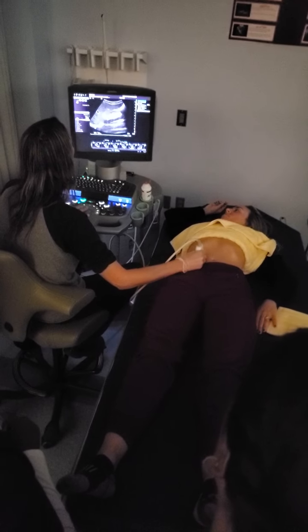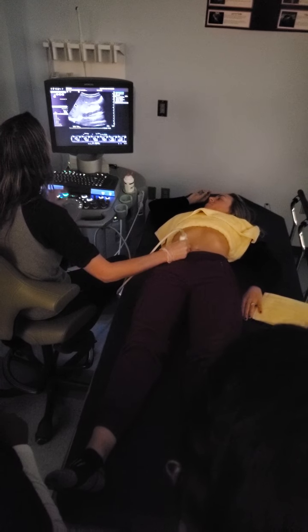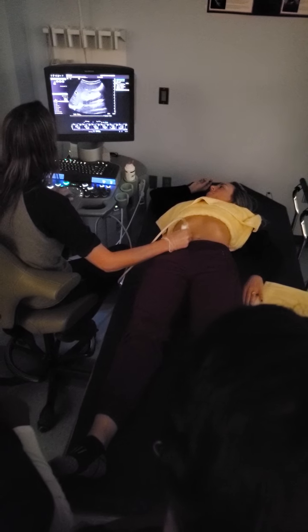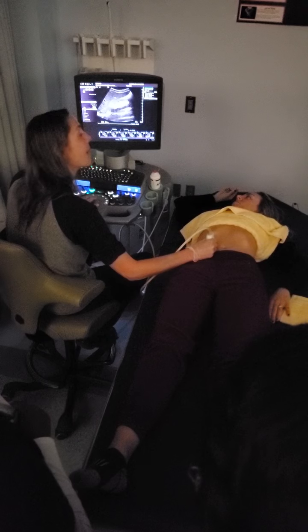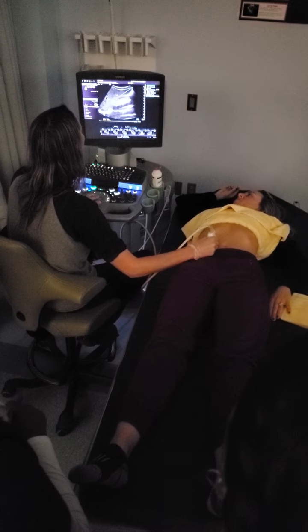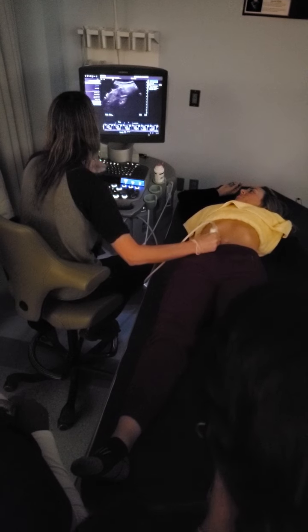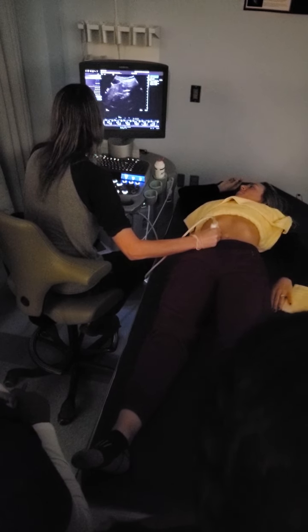Superior, posterior, right? And we want to make sure we're inside the diaphragm, just where that parenchyma of the liver starts. And then we're going to go to the next one. Anterior, inferior. You got it. And there's our measurement. And the one I skipped over because I'm an idiot is going to be our other measurement. Let's do that real quick while we're there.